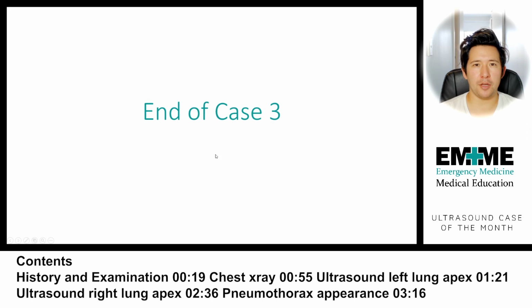Thank you for listening. I hope you learned a little bit about lung ultrasound when looking for pneumothorax. It's a very sensitive test, and it's a very good way of helping to diagnose or rule out pneumothorax, either in trauma or in other situations.